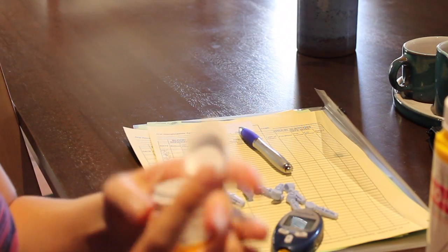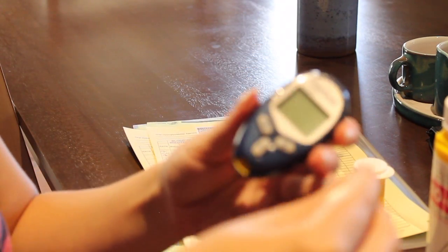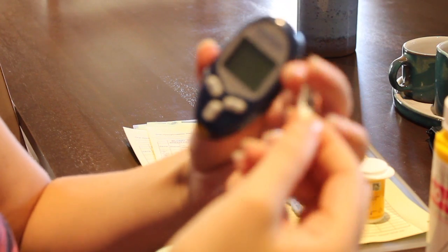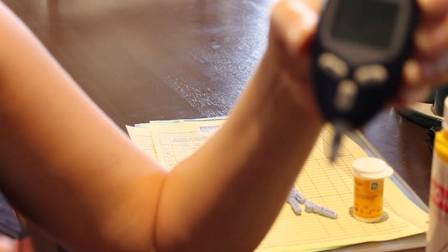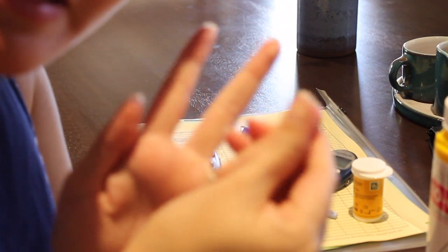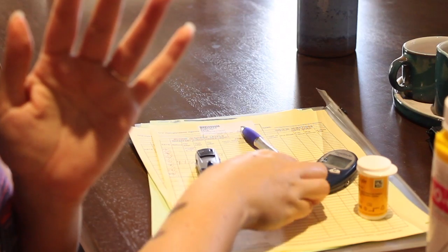First, you want to set up your test strip in the meter. Now, butterfly is up, little points are facing out, this top part goes in. Push it in, you can see drop of blood is splashing, so that is ready to go. Again, since it's been a couple minutes, I'm going to quickly massage my finger like so to make sure the blood is flowing all the way up there to the tip. Get these lancets out of the way.